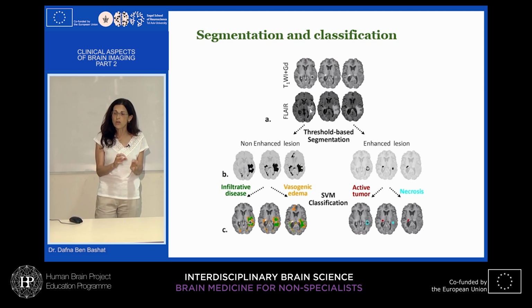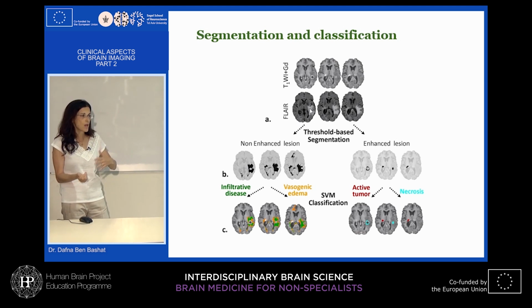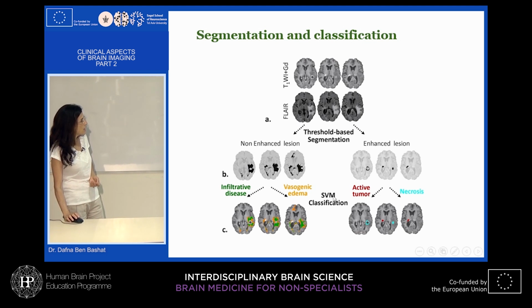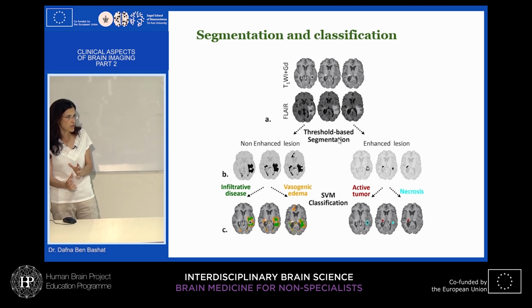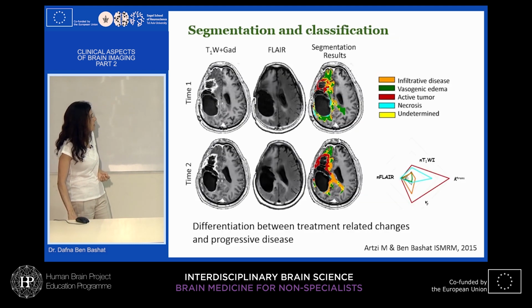And if we know that, then the oxygen extraction fraction will change. Then we build the protocol, get all this information, and can have 5, 10, or 20 parameters for a voxel. Then we need computational methods, any algorithm, supervised or unsupervised, doesn't matter the approach, to enable this. This is the approach of the computer-aided diagnosis tool: we get all the information and hopefully give the radiologist something more than just the volume changing, namely that the malignancy is changing.